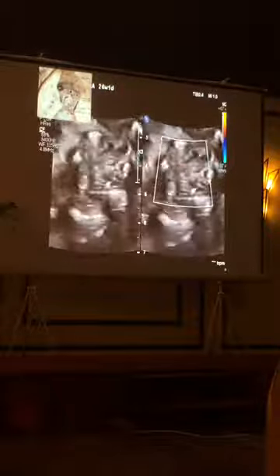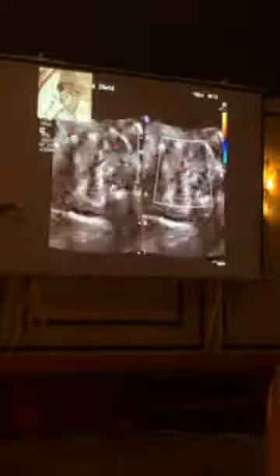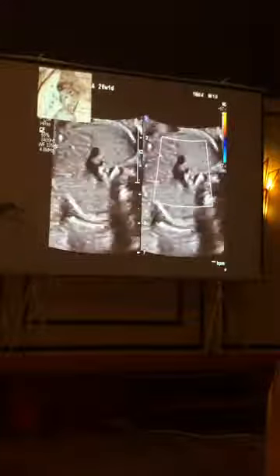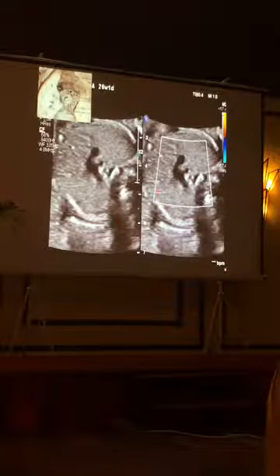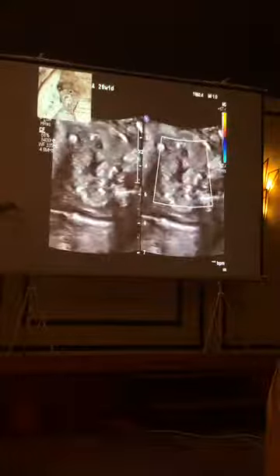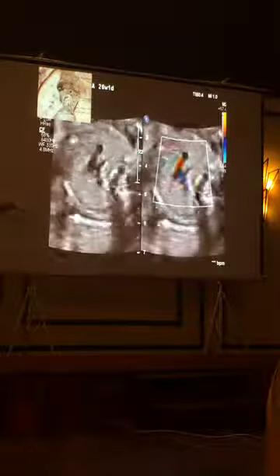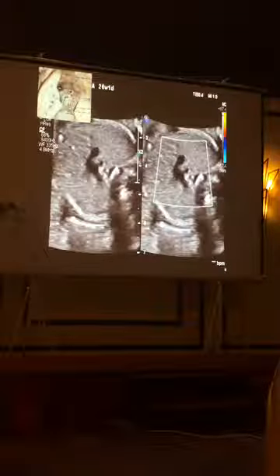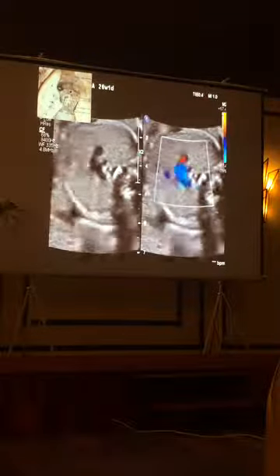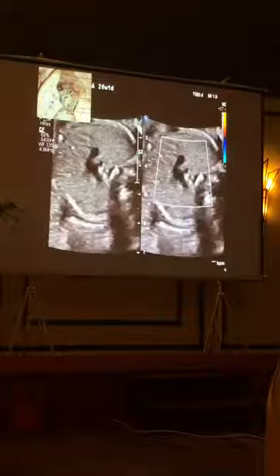You just have to know what you are looking at, because as a matter of fact, it's useful, and I showed you before that in this kind of image, we can see the origin of the right subclavian artery that sometimes is showing here. So when you want to diagnose the aberrant right subclavian artery and you are not sure, if you can see something like this, certainly this is a normal subclavian artery.